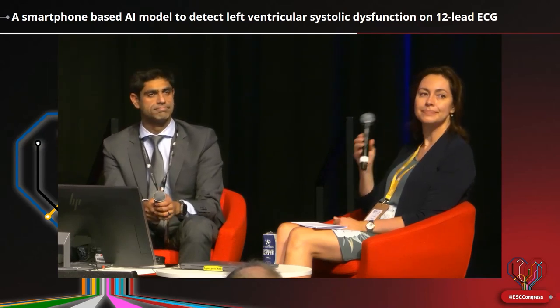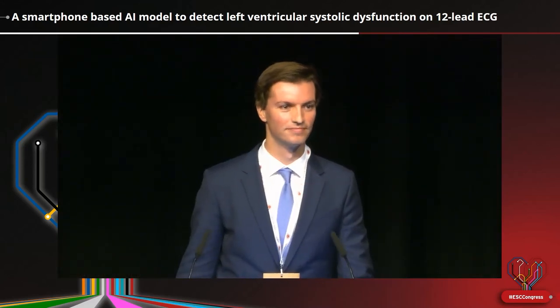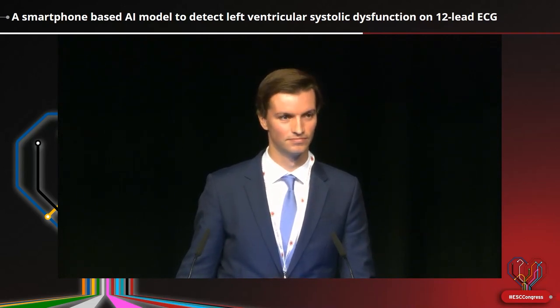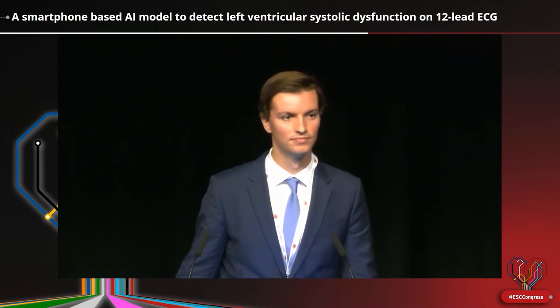Hi, excellent presentation. My name is Rishi Trivedi. I'm a cardiology fellow and AI researcher at Cedars-Sinai in the U.S. I'm curious, the echoes that you used for the training, do you know what the volume status was for these patients? So are these echoes outpatient, inpatient, decompensated heart failure or not? Because that really does affect what you're actually detecting on your ECG.